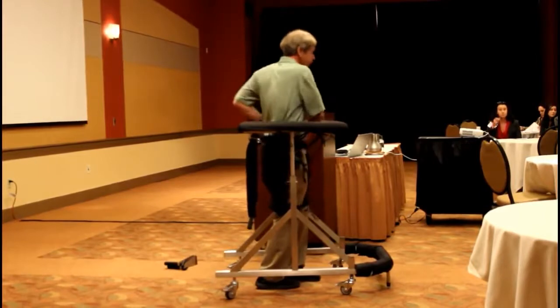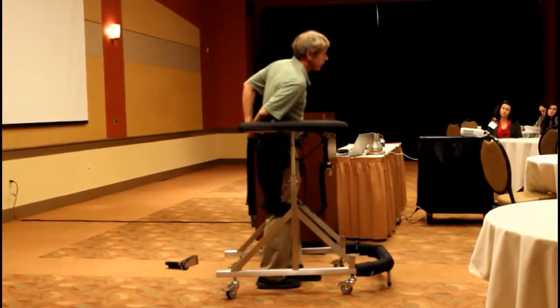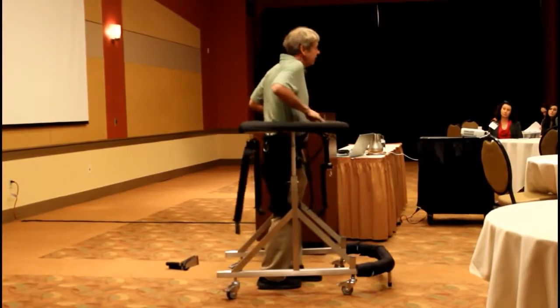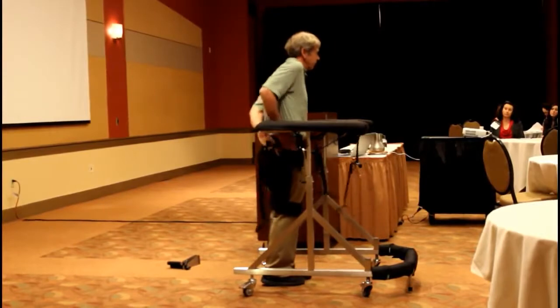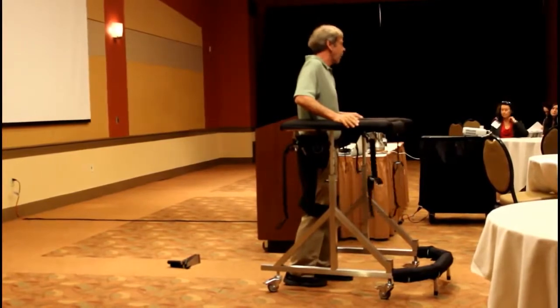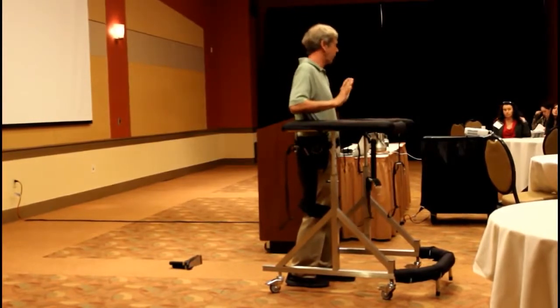The logistics are primarily, you would want to have someone in a seated position, like at a bed or a mat table. So you do a sit to stand. And it sounds more complicated than it is. We have had people with very severe disabilities that we can get in and out of this. But it's a process that is well worth the investment because the outcomes are so strong.